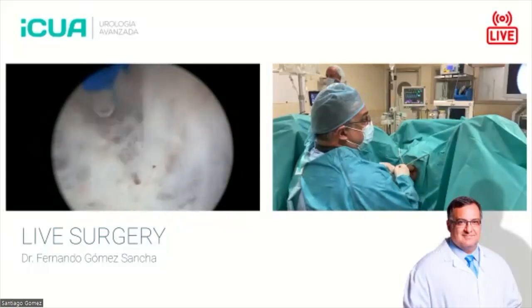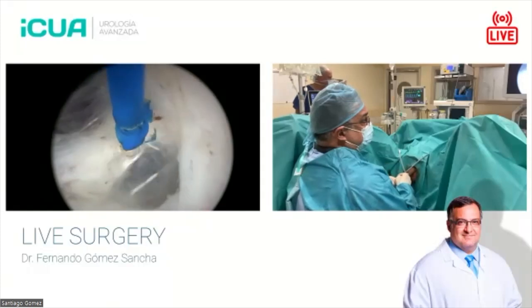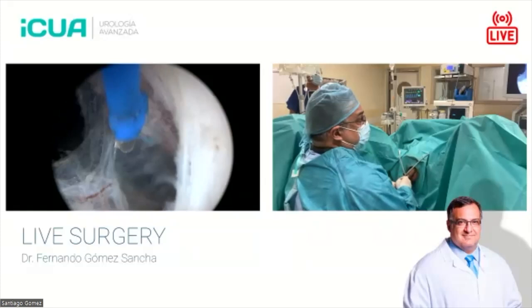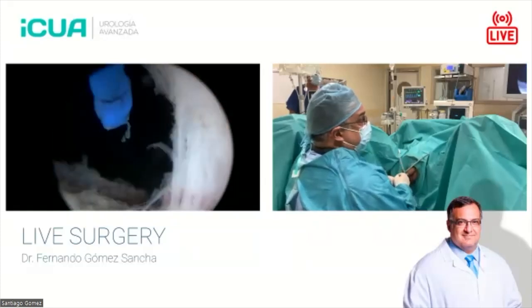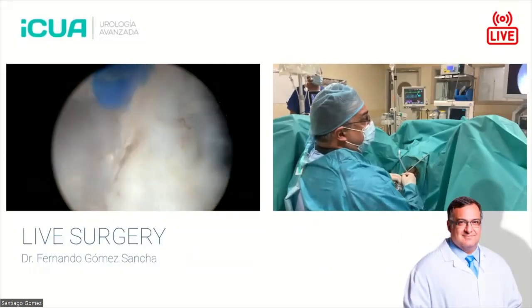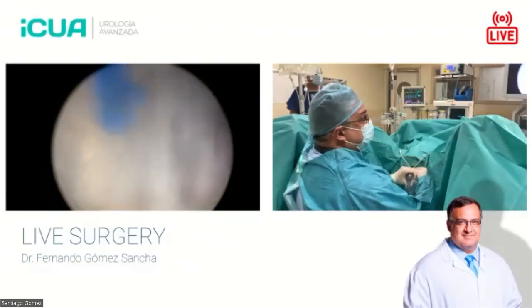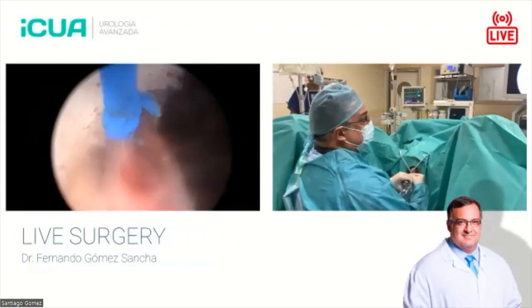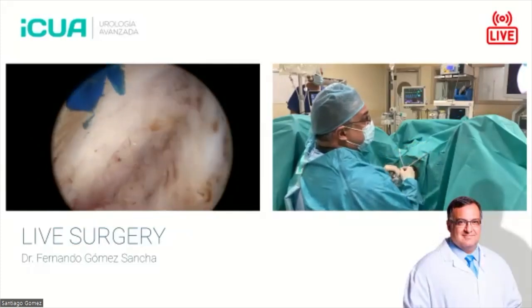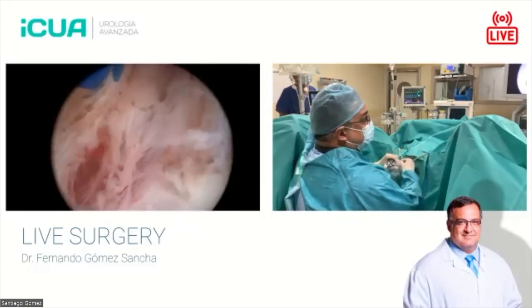So sometimes I am convinced that I am using a high power laser, but maybe the amount of energy I use is not so high, because it's a very efficient use of energy. Whereas a beginner will have a low power laser, and will have to go several times over the same position. He will have to stay longer. So maybe at the end, the amount of energy that the tissue receives is not radically different.